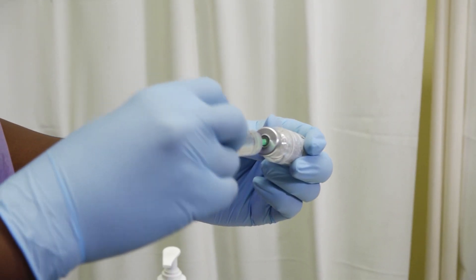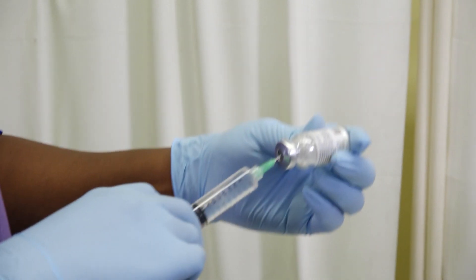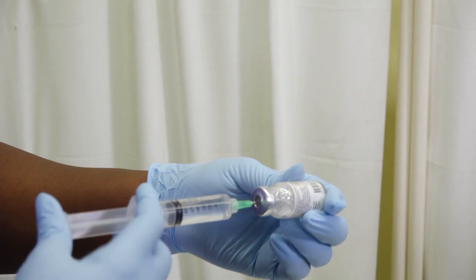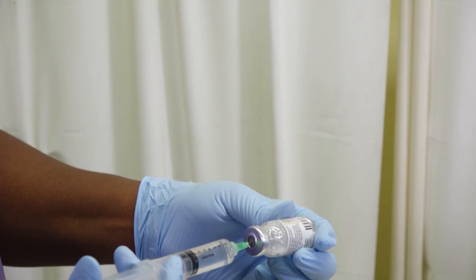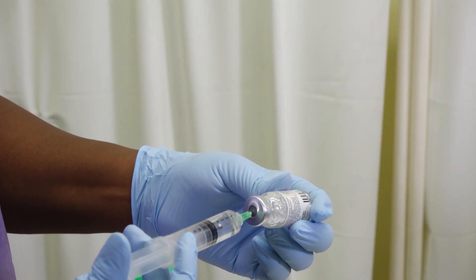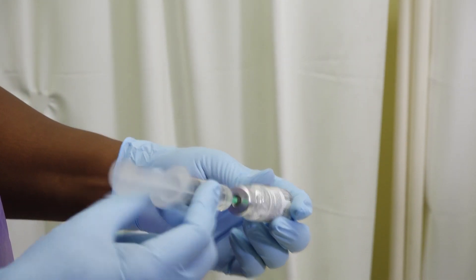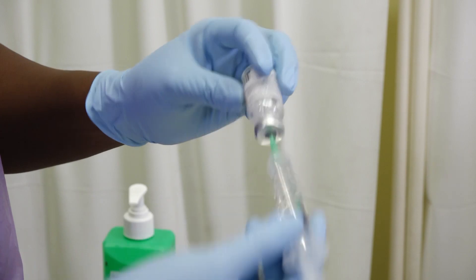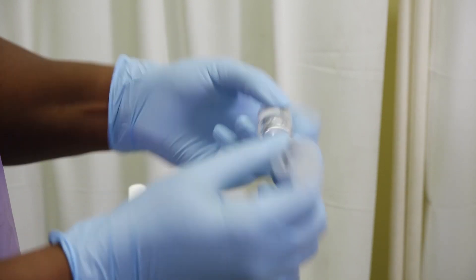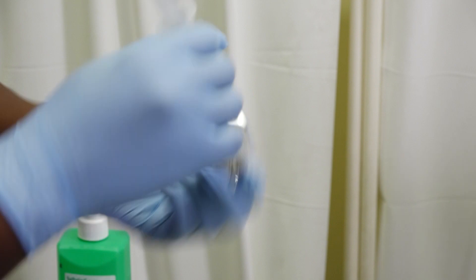Press the rubber stopper on the vial and inject between 2 and 5ml of water for injection. Agitate the bottle and solution until the powder is dissolved.